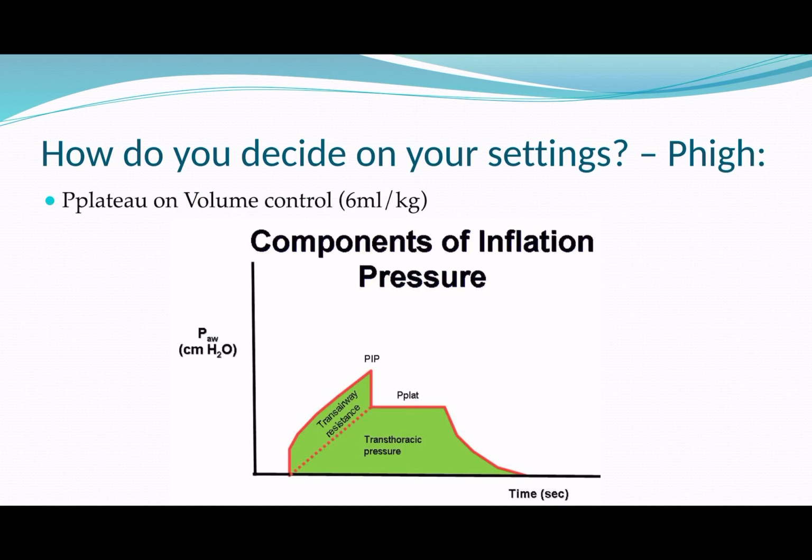So, in this talk, we're thinking about how we set the PHigh, the pressure high. When we have a patient in front of us, we're setting them up on APRV. How do we know what settings to set them on? Well, the next 4 talks are going to be going through each of the different 4 settings that we're going to have. However, the first of those is the PHigh. This is the high pressure that we're going to keep. This is the extreme CPAP equivalent PEEP.